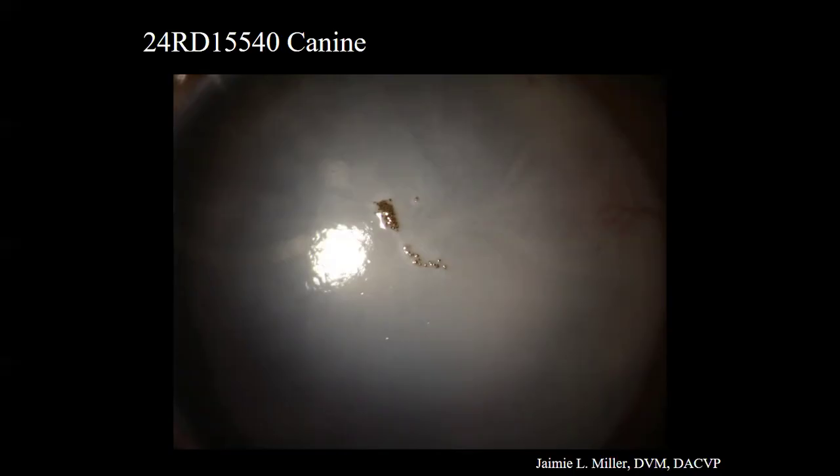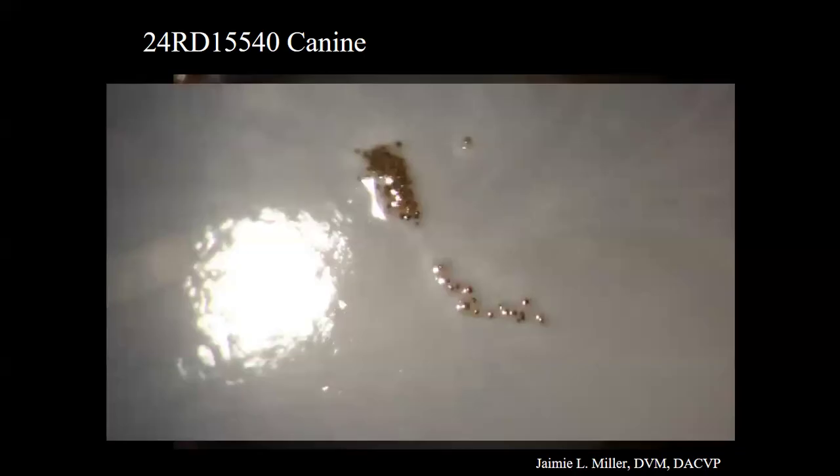But their main concern, or more pressing concern at the moment, was that the center of the cornea developed an unusually darkly pigmented bubble-like mass, which was not present 3 months ago, presumably when they saw the dog. It's pretty cool. Under slit lamp biomicroscopy, the mass seemed to be inside the corneal epithelium, beneath it.